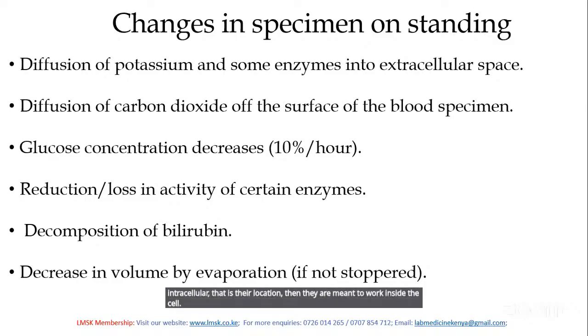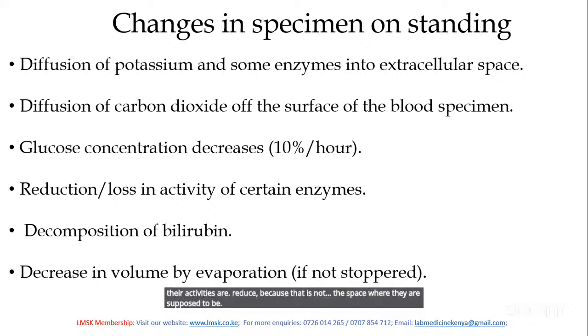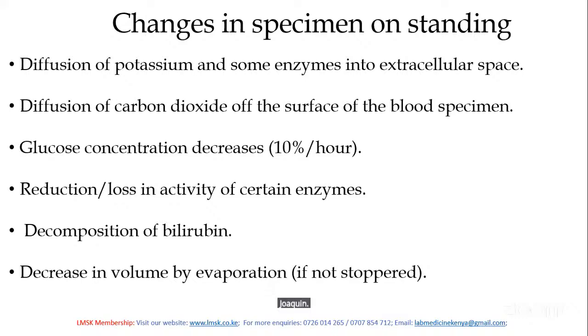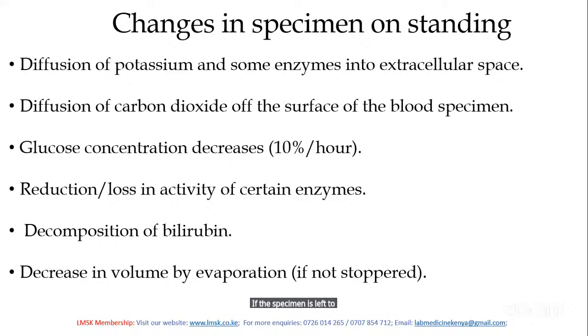Meaning, if they get to the extracellular space, their activities are reduced, because that is not the space where they are supposed to be working. Then there is a tendency of diffusion of carbon dioxide off the surface of the blood specimen, if the specimen is left to stand for quite a long time.